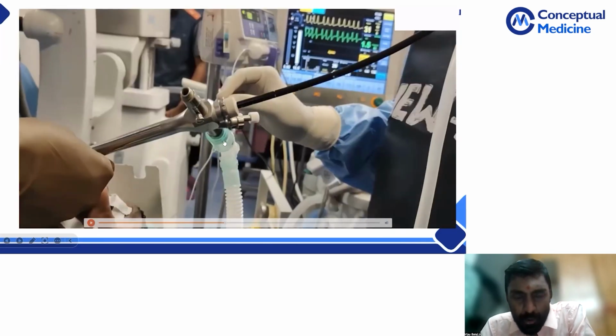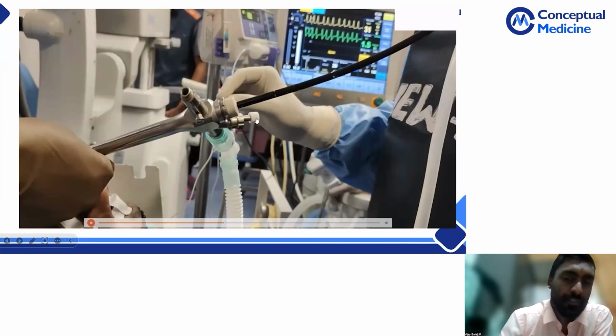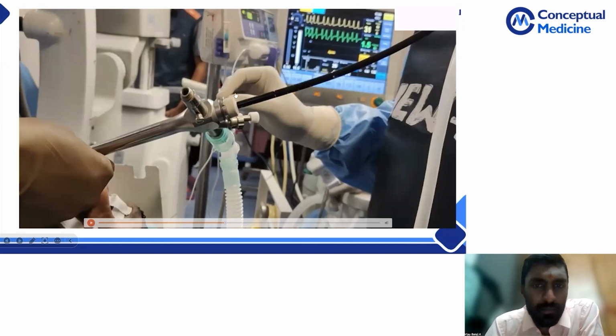You see, this is the port where your ventilator is connected. Okay. This is a suction port. Okay. You can attach suction to it, or you can attach your Fogarty balloon. All of this you can put here. This is your normal working port or a channel wherein you are using a flexible bronchoscope.